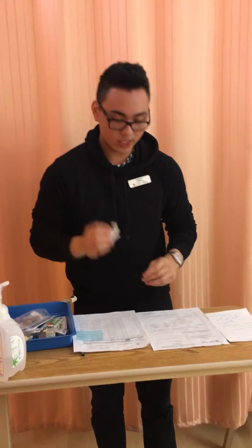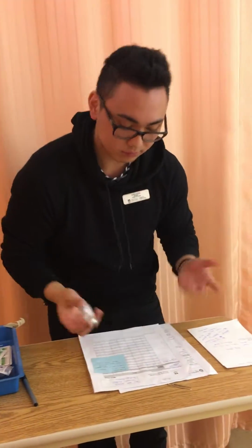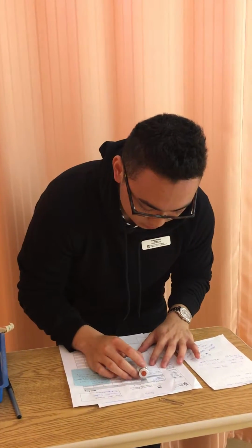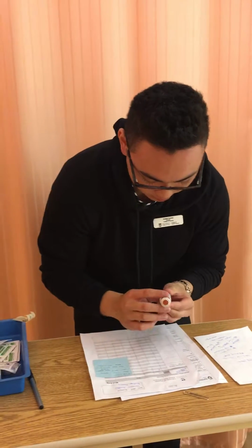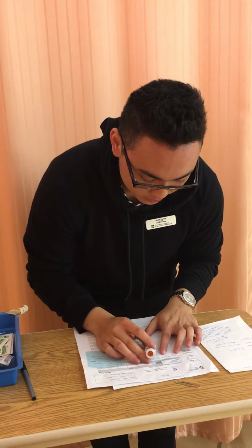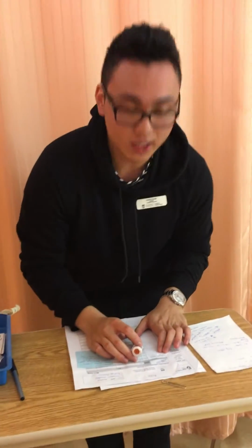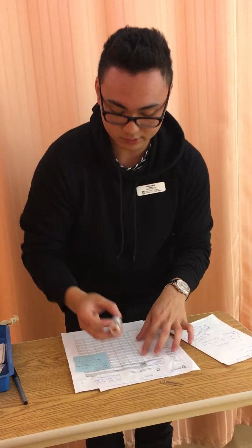Okay, so we have our drug here. We're going to do our first med check. So, right patient, Penelope Pacheco, states that she has no known allergies. Okay, so we have our right drug here. We can also check if there's any expiration dates. There's none. And the right dose, 750 milligrams, I give an IV every 8 hours, and it's due right now.